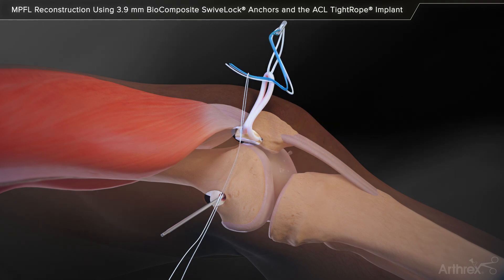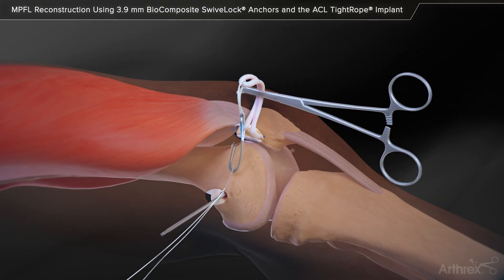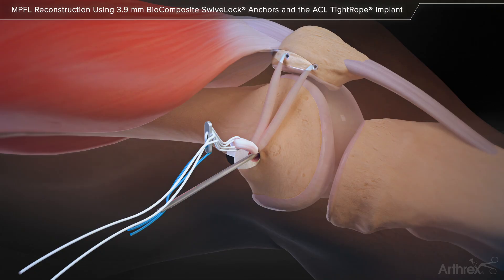Load the white and blue suture from the tightrope into the tiger wire shuttle suture loop and pass the sutures from the patellar incision to the medial femoral incision. Deliver the sutures out of the medial femoral incision with equal tension on both graft bundles. Loop the blue passing sutures from the tightrope into the eyelet of the 4 mm spade tip pin, leaving the white tensioning suture behind.